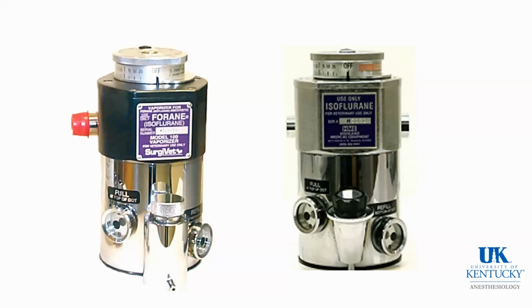These isoflurane vaporizers, both of which appear not to have key-specific fillers, are representative of the early days of these vaporizers. As you can see, one of them is labeled Surgivet, and obviously is a veterinarian product.